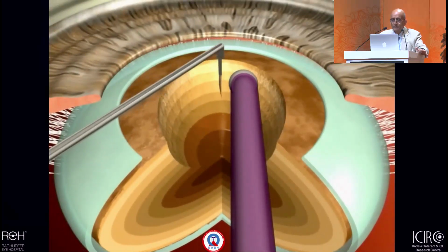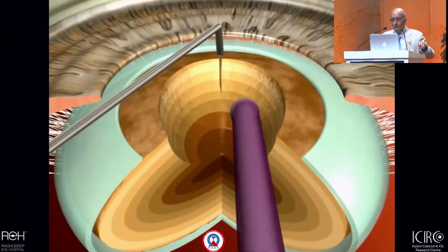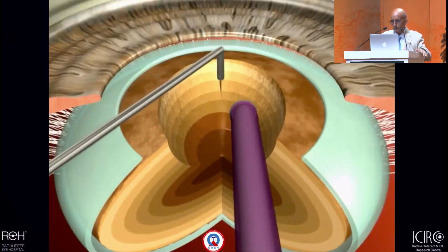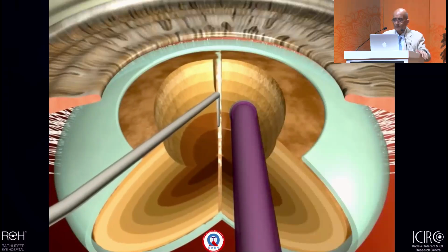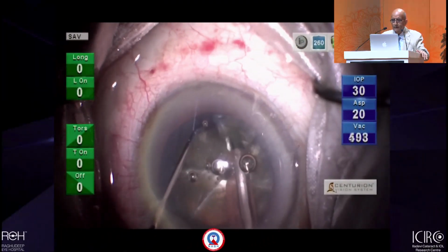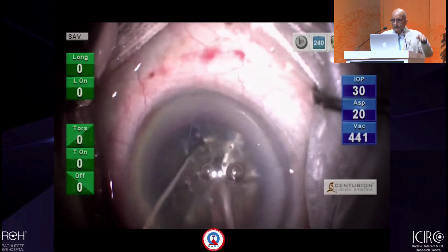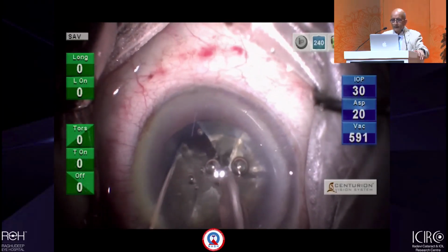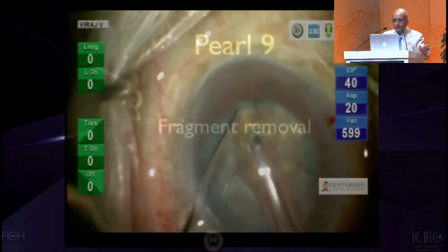Start the division, take both the separating forces, the occluded tip and the chopper, again nearer to the plate that you want to divide, so that you don't have to have a lateral separation movement as much as you would otherwise. And this illustrates what I'm saying. I'm taking this occluded tip once again and re-occluding it at the depth, and then I can achieve that crack very well. Once again, similar thing.